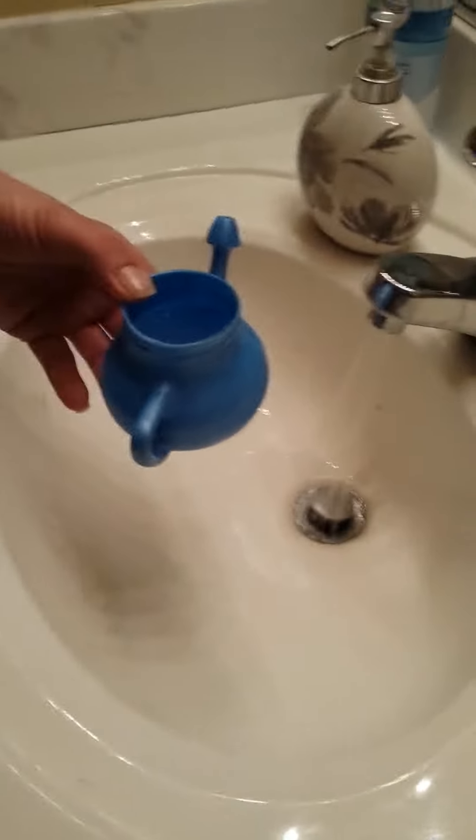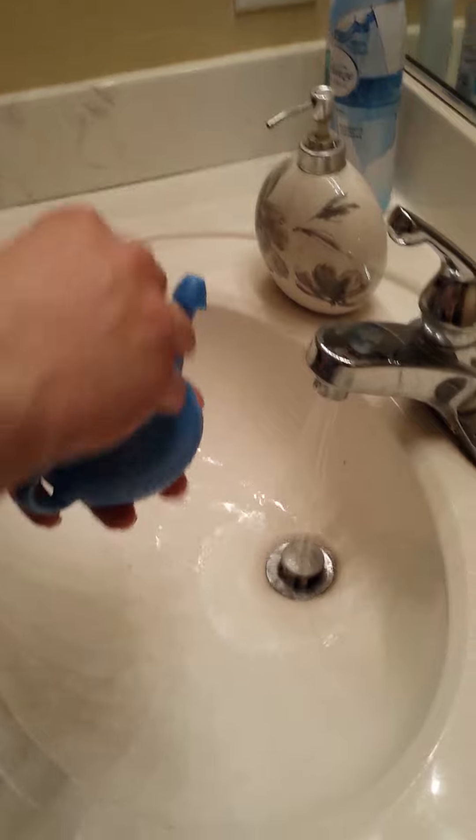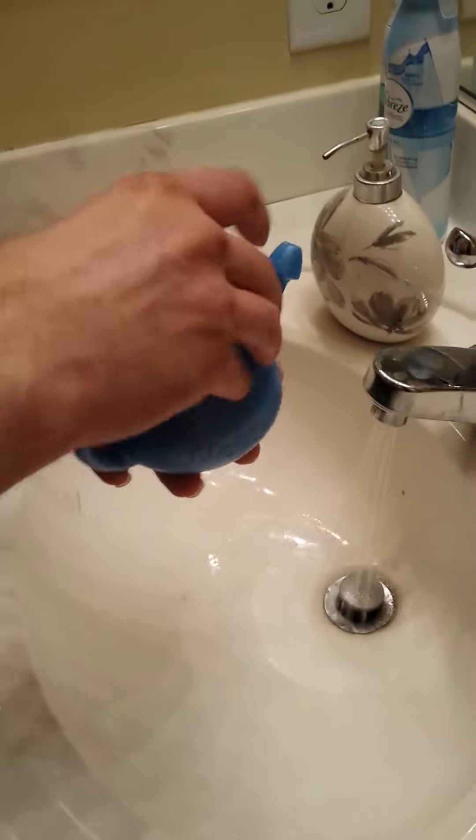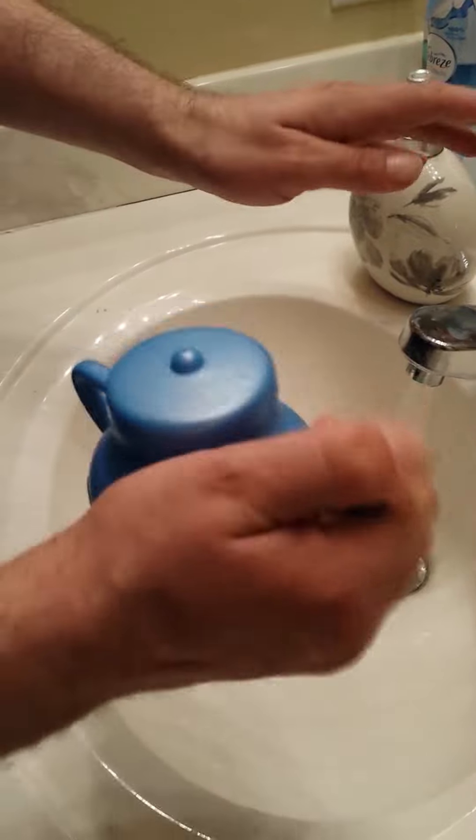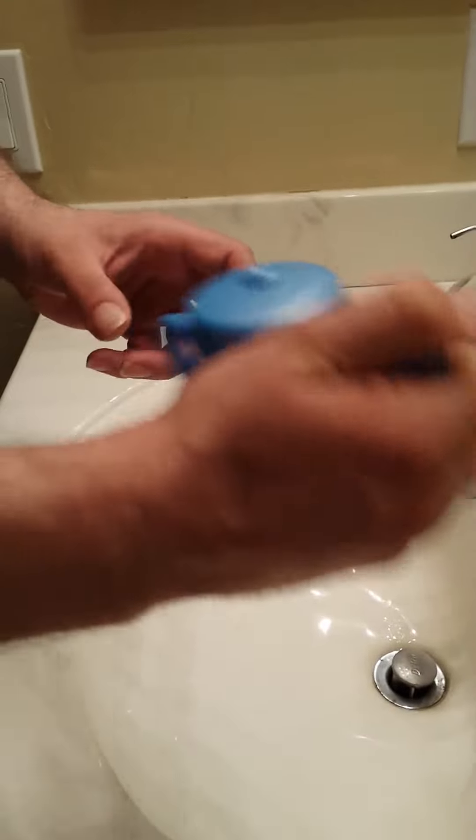Fill it to the fill line — very important. Mix — very important. And get ready for the nastiness.